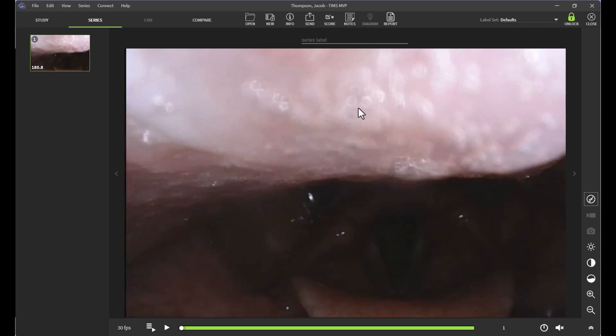This video reviews how to utilize subclips in the TIMSS MVP software. For those who are conducting FEES studies and recording the entire study with no pauses in between, this tool can be beneficial because it allows us to isolate out individual trials or segments of the studies.